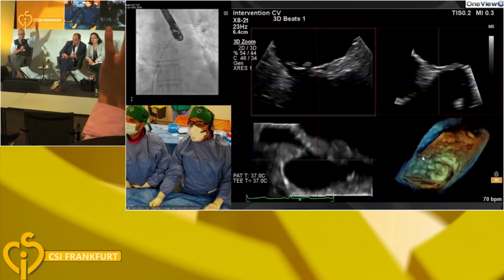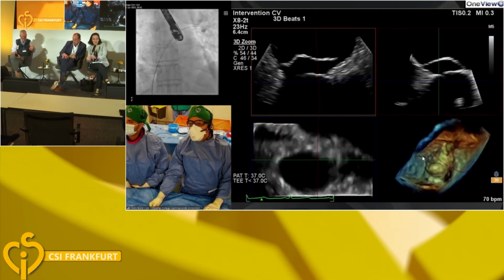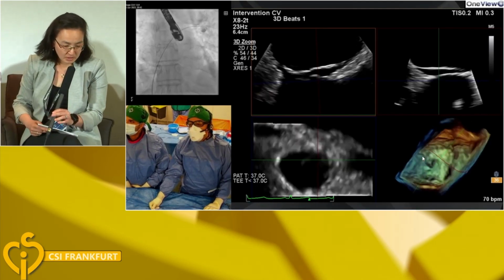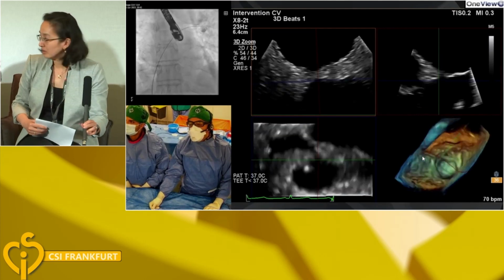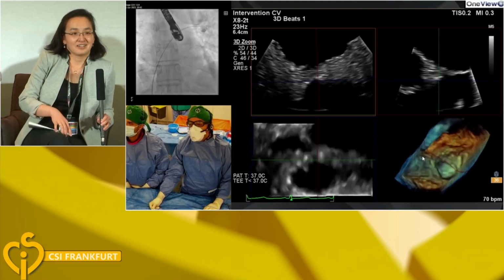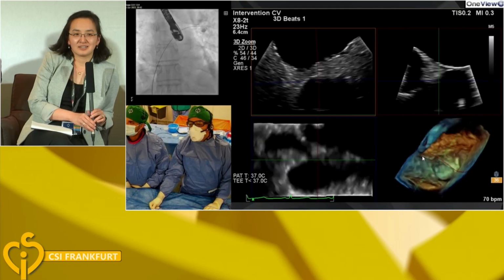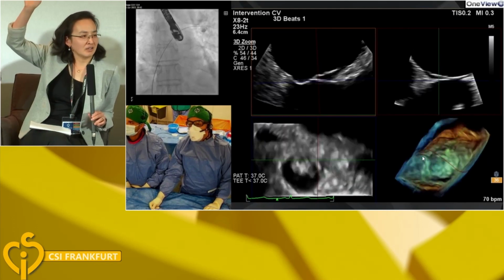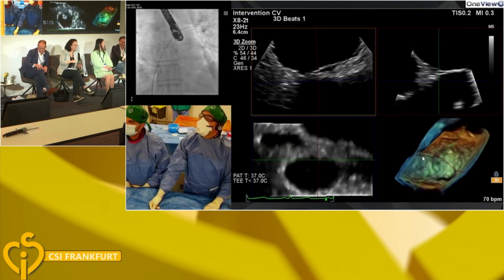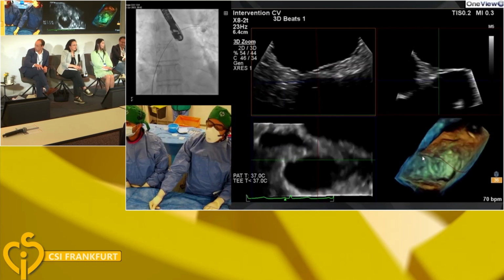Yeah, nearly everybody. So Bushra, the poll in the majority room is almost all the hands went up for balloon sizing. But I know you're going to teach us 3D TEE here and how you're sizing it. Before we do that, because we don't know what we don't know, hands up who would not balloon size. Okay, so there is a good minority that won't balloon size. Did you raise your hands all again to the same people? It looks like they all raised their hands twice. Can anyone explain why they wouldn't balloon size, given the uncertainty of the anatomy?